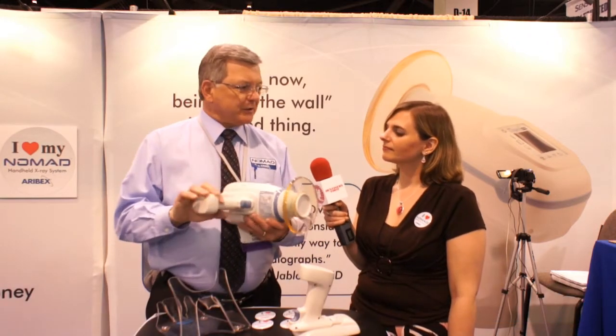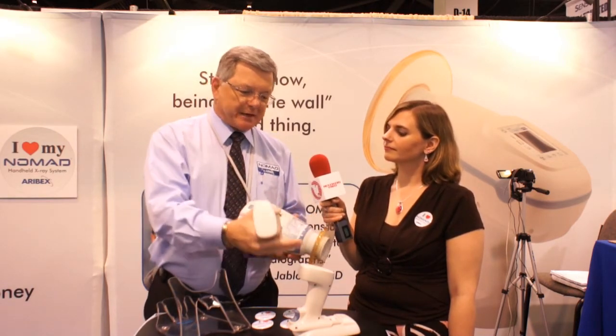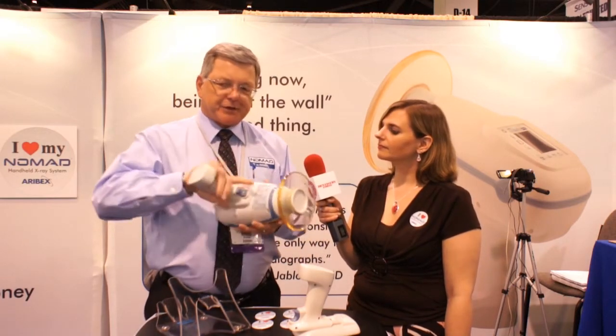And what product are you showcasing today? Well, today we're going to show you the Nomad Pro. This is our second generation Nomad Handheld Portable X-Ray. It's battery powered, has a battery built into the handle here that snaps on and off. Two batteries with every unit and a recharging cradle. About 400 exposures per battery charge. It gives you the ability to take it from operatory to operatory — one Nomad will work in about three to four operatories, depending on the nature of your practice.